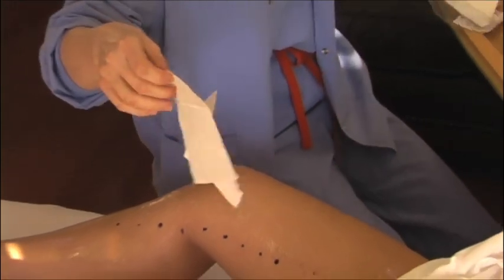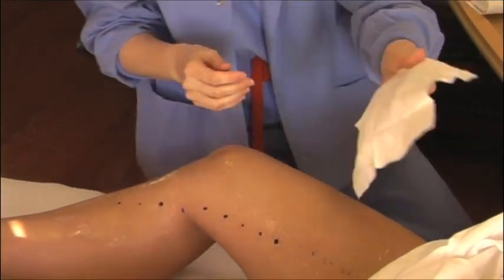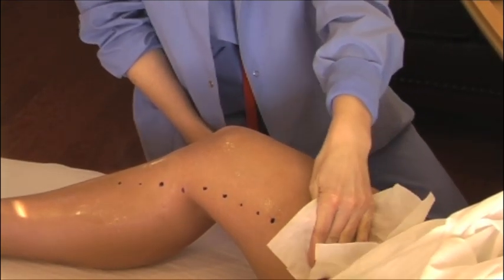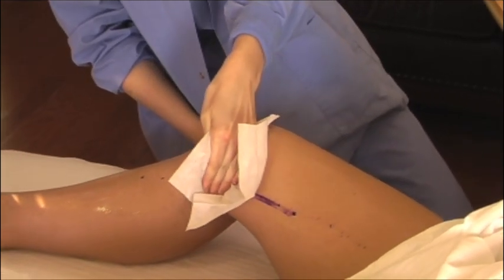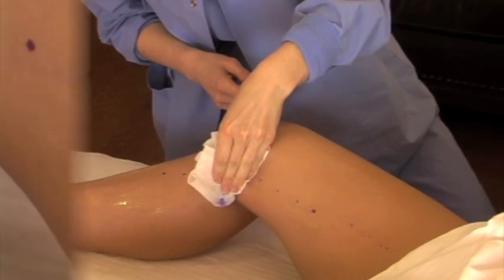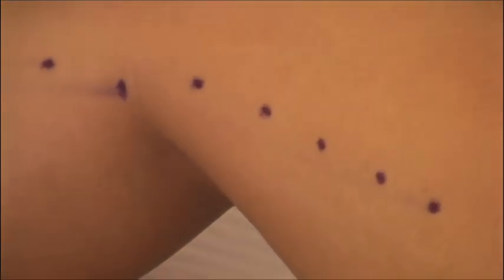When you are finished marking the target anatomy, utilize the towelettes to thoroughly remove the gel and residual ink. It is recommended that you wipe the skin in one direction as demonstrated here. Allow the skin to dry adequately prior to using the accessory skin marker.